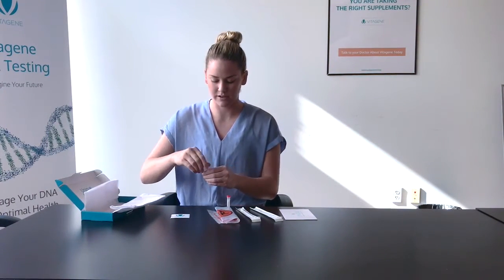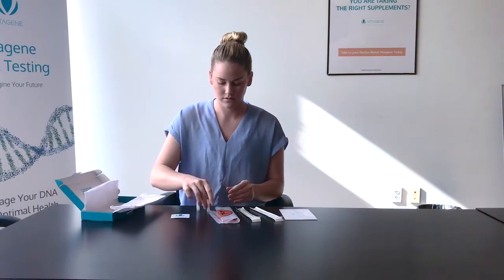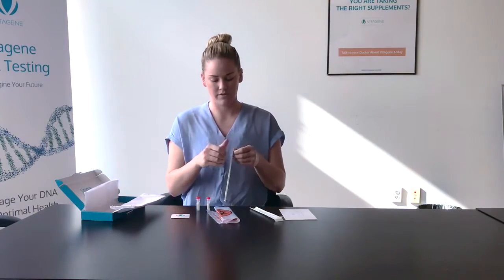First, loosen the caps on each of your vials. Then, open your first swab and swab on the inside of each cheek for 30 seconds.